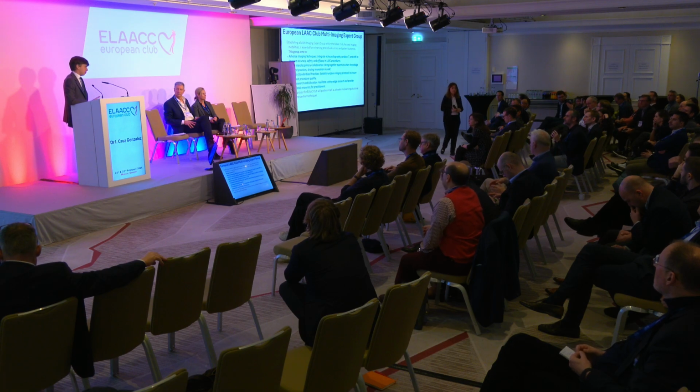Good. And another question I raised during my presentation: do you think it's worth making a direct comparison between the micro or mini TEE probe, or the ICE catheter? What is your opinion, Lara? I think the micro is not fair to compare, because the micro has no 3D capabilities at the moment. But is it worth comparing the mini TE and the 3D ICE? I'm trying to say, compare the 3D ICE catheter versus the mini 3D catheter.